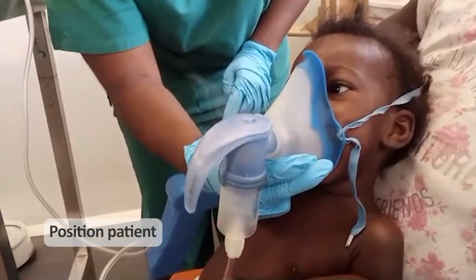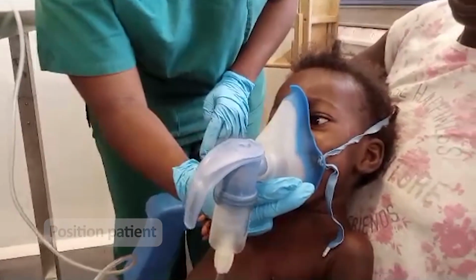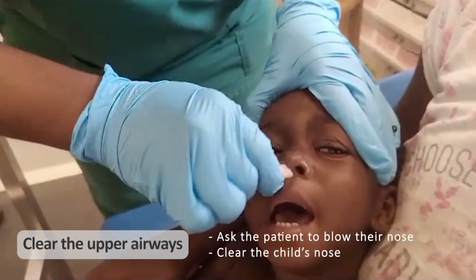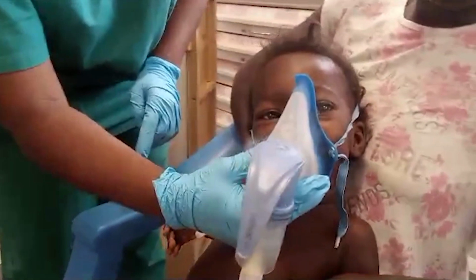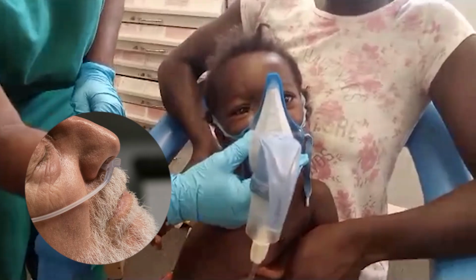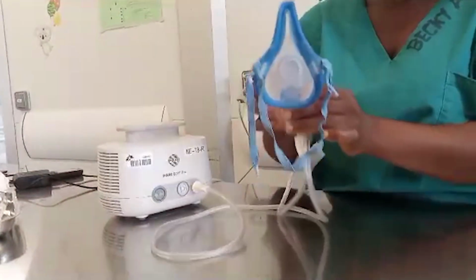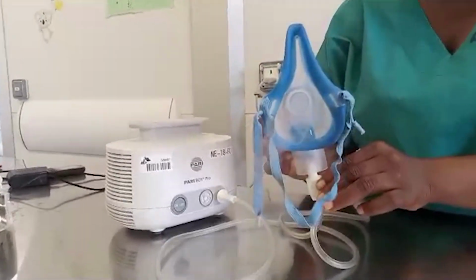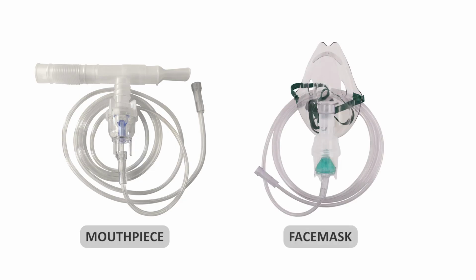Position the patient upright in a sitting position. If necessary, clear the upper airways by asking the patient to blow their nose or clearing the child's nose. If necessary, ensure that the patient is receiving oxygen via nasal cannula. Turn on the nebulizer and observe for mist. There are two techniques to administer the medication: one using the mouthpiece, and one using the face mask.